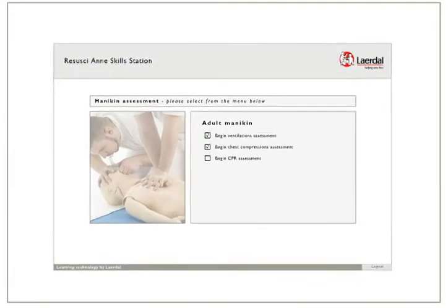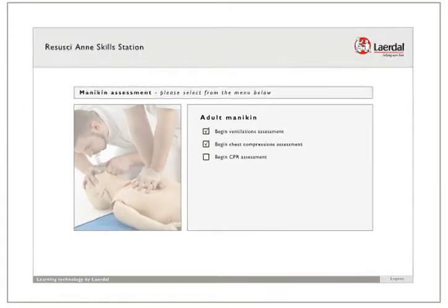Welcome to the Resusci Anne Skills Station. This short introduction will guide you through the use of the system.